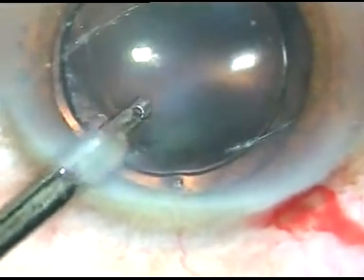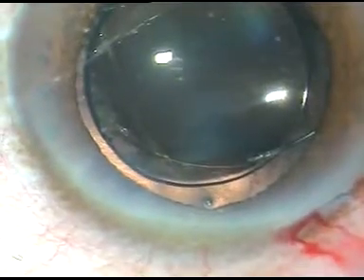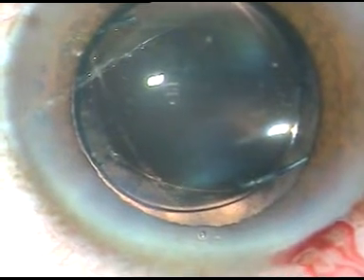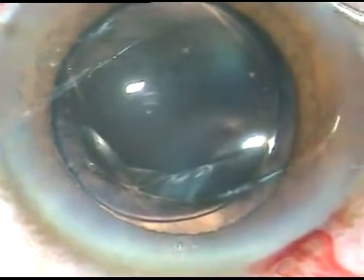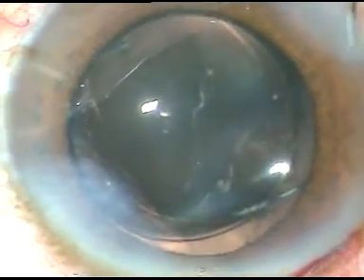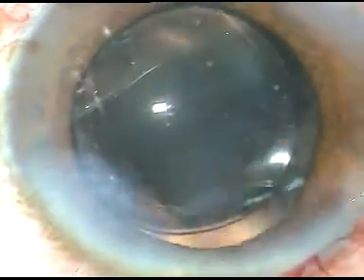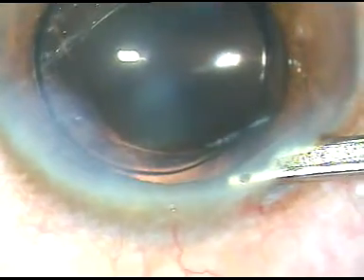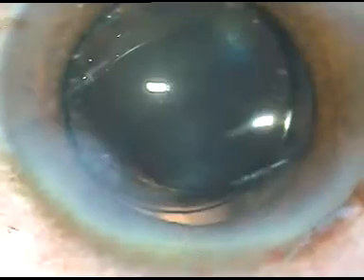The anterior chamber is formed nicely. Hydration of the side ports is done. It was a long surgery of about 25 minutes — I have edited out about 5 minutes. Dear friends, patience is very essential in such cases. Unless you have patience, you cannot do such surgeries. Hope this video will help you in developing your skills in cataract surgery. Thank you very much for your attention. The anterior chamber is formed and the case is concluded.